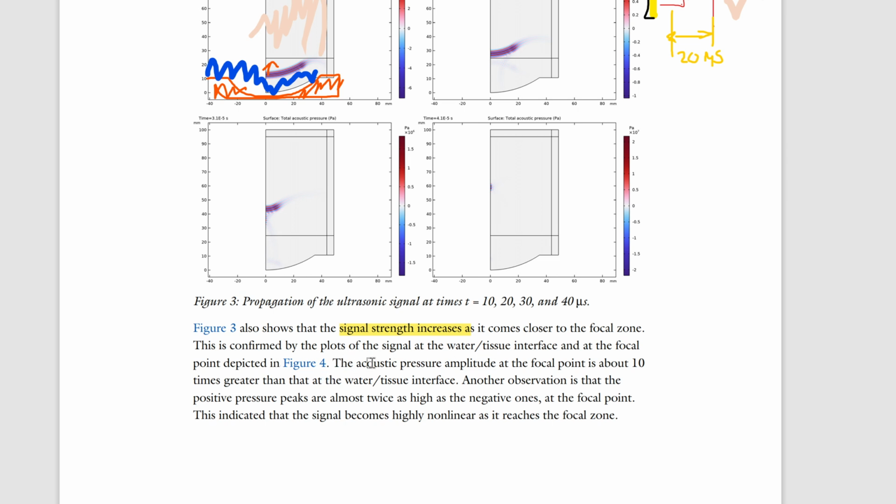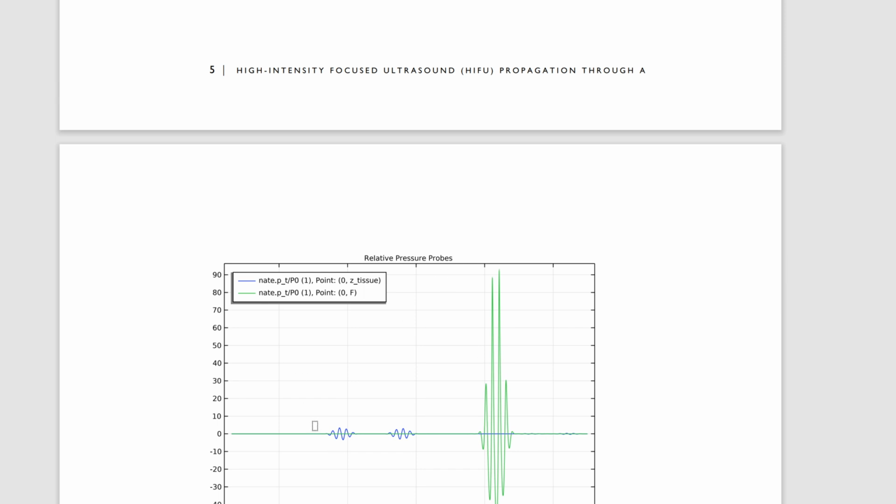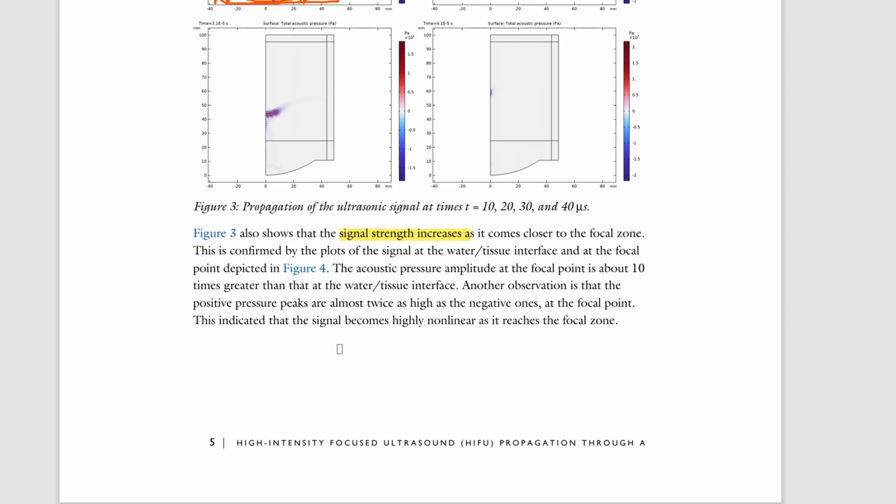The acoustic pressure amplitude at the focal point is about 10 times greater than that of the water tissue interface. Okay, hear this? Yeah, I can see that. We're at about, yeah, maybe like 3 or something here, 5, I don't know, less than 5, 4. We're at like 90 here, greater than 10 times. So it's about 10 times greater. Okay. Another observation is that the positive pressure peaks are almost twice as high as the negative ones.